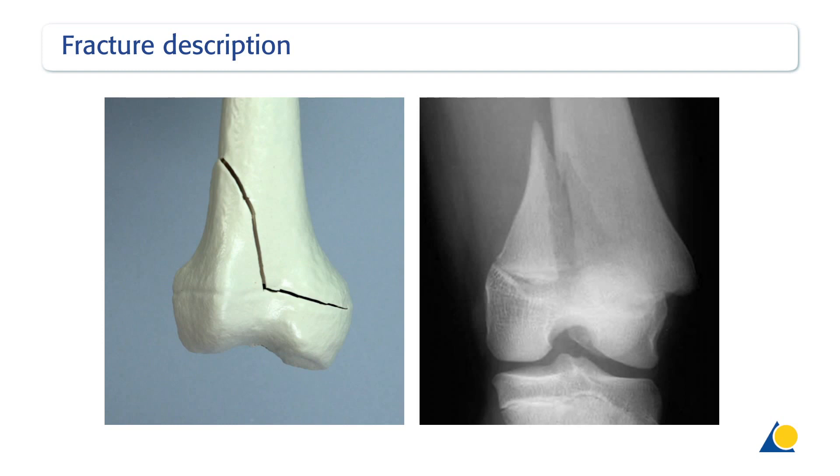If the wedge is very small, the fracture looks like a Salter-Harris type 1 fracture and can be fixed with two crossed K-wires. If there is a large metaphyseal component, this may be transfixed, ideally with two cannulated screws.